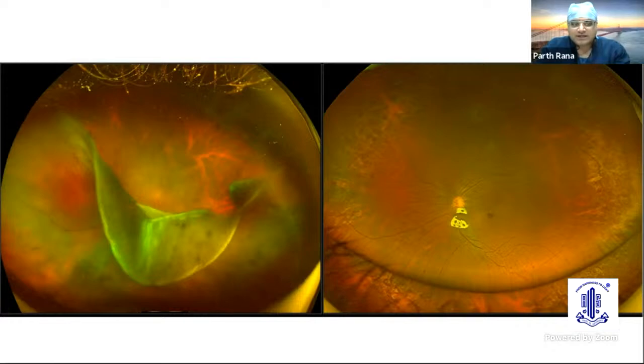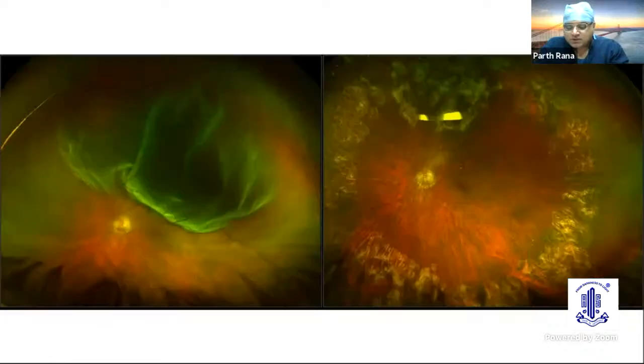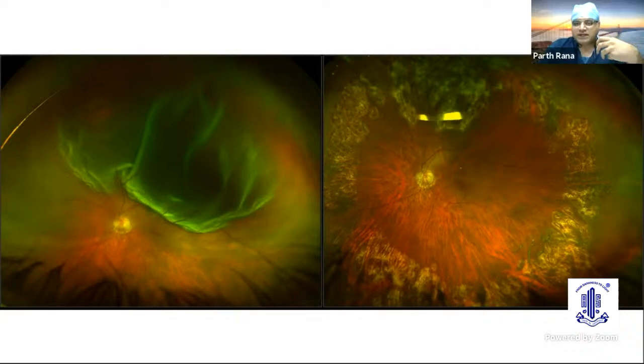There is one more case of giant retinal tear, and the patient was not able to understand how it can happen. I just showed the patient this is the thing and it has fallen like this. When the patient saw the picture, the patient was able to imagine how it has happened, understood, and went for surgery. We operated on the patient. On the next day, the patient was able to see, and we showed that your retina is totally on, and the patient was happy. So even this kind of case is for retina. It's not just for medical purposes.